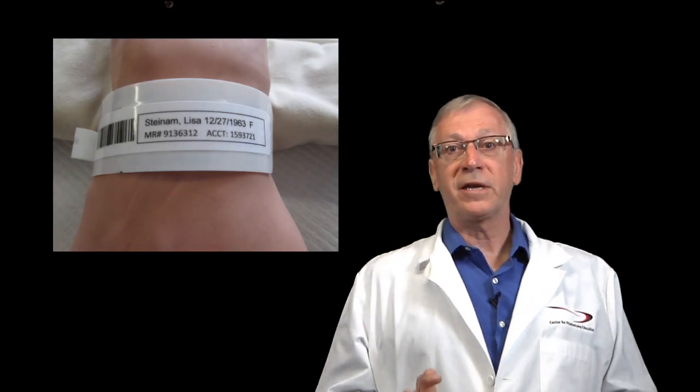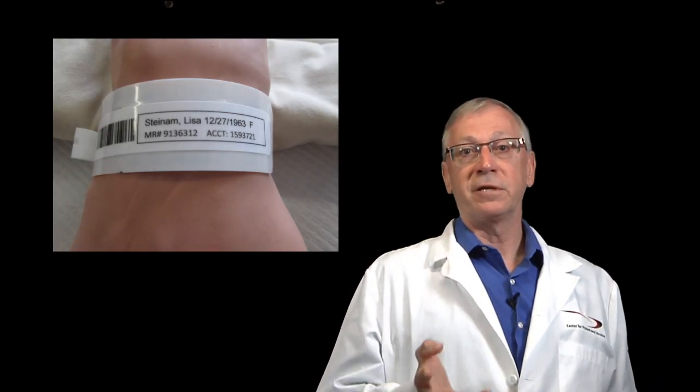So could it be any plainer? The patient provides their full name and birth date, spells their first and last names, you compare it with the information you were provided and their ID band if they have one and only if it's attached to them. All inpatients must have an ID band unless they are exempt by facility policy. For example, in psych wards or patients in isolation. The standards require it.